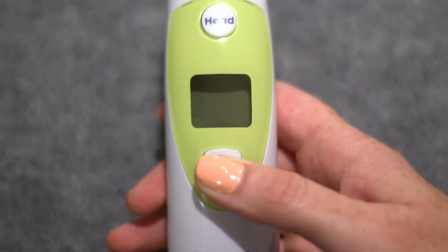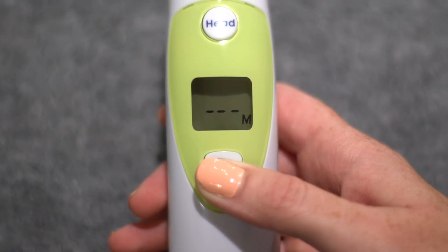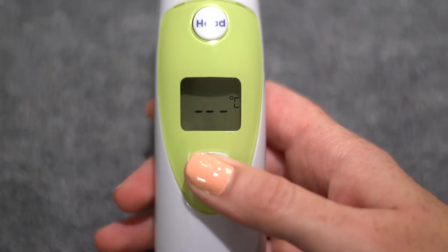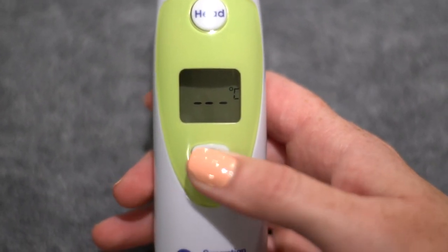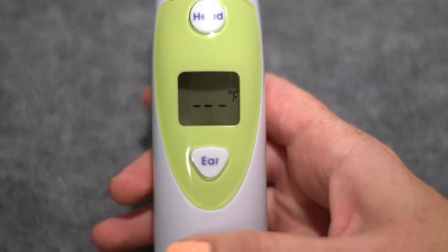Switching between Celsius and Fahrenheit: while the thermometer is off, press and hold the ear button for eight to twelve seconds until the Celsius or Fahrenheit temperature unit is blinking. Click the ear button again within five seconds to change the temperature unit to either Celsius or Fahrenheit.